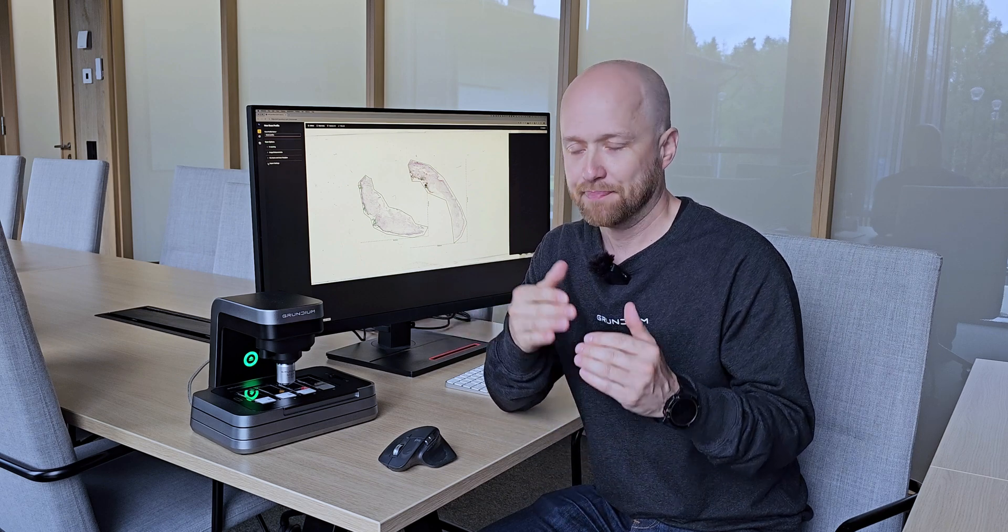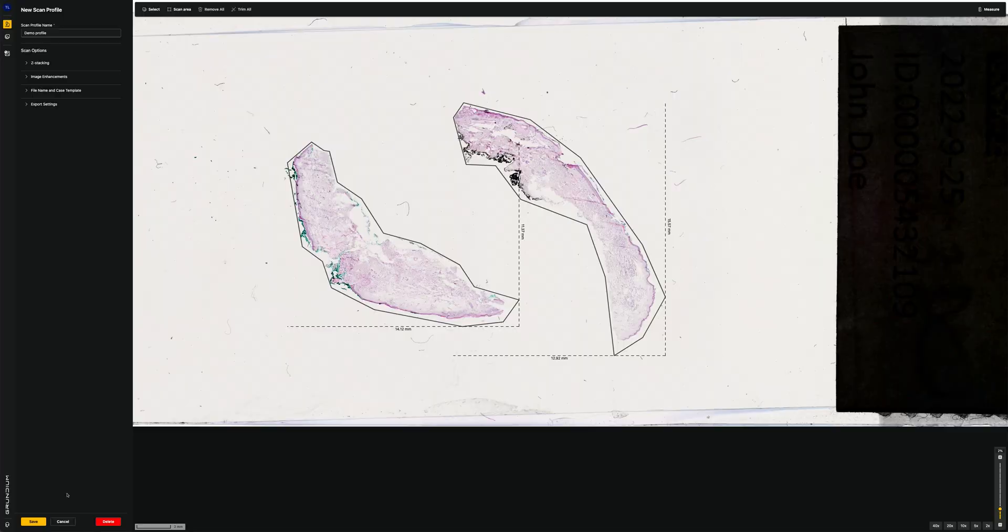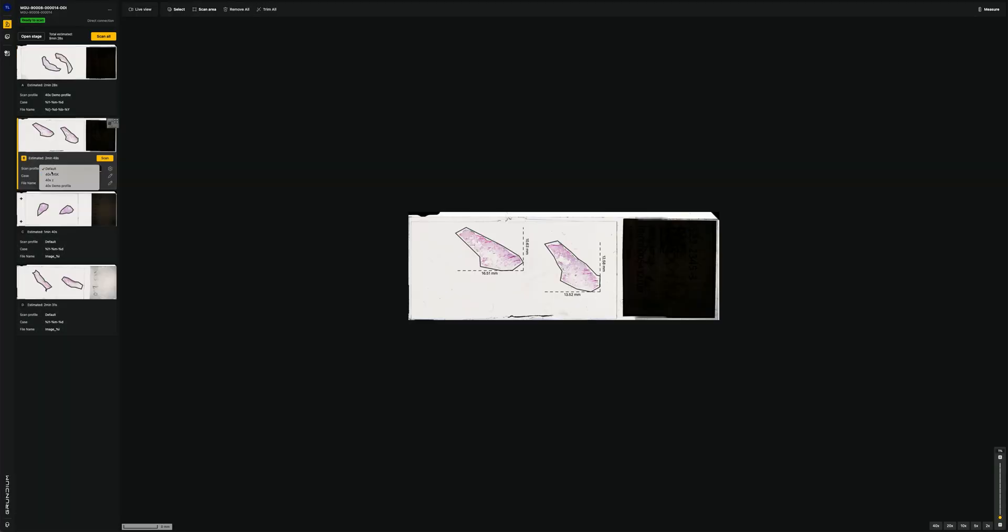So that's very handy when you, for example, want to export different files, different cases or different locations. You can insert that information into a scan profile. And when you're scanning, just choose the preferred scan profile.